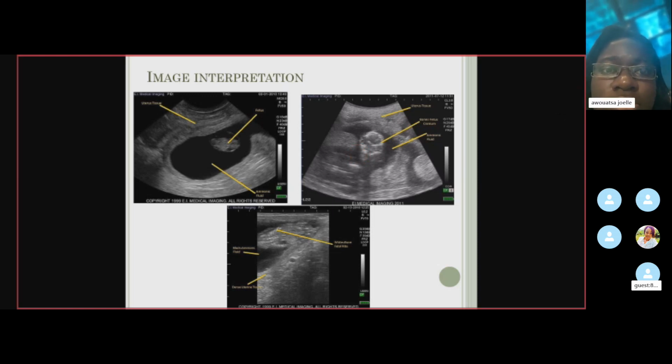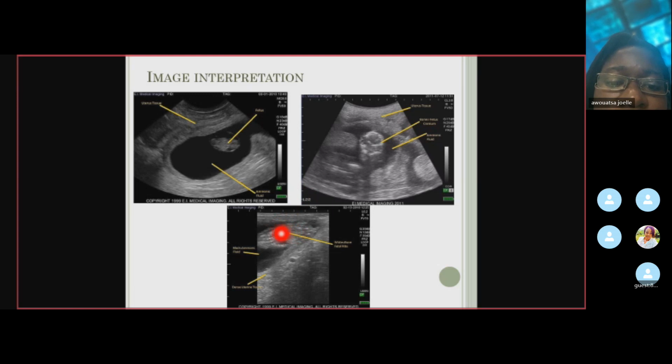Okay, so it appears bright. In the second last picture, you can see white spots. These are the rib cage of that fetus, where it appears white. See here, there is fluid which is appearing black, and all the rest of the tissue is appearing gray.